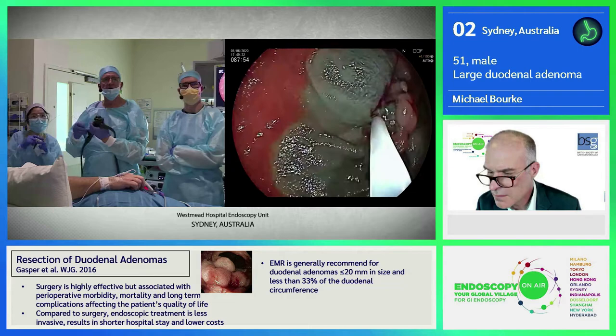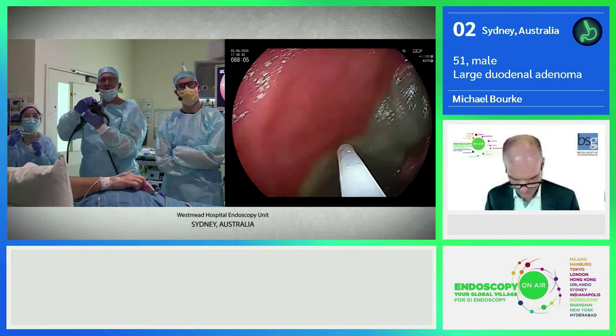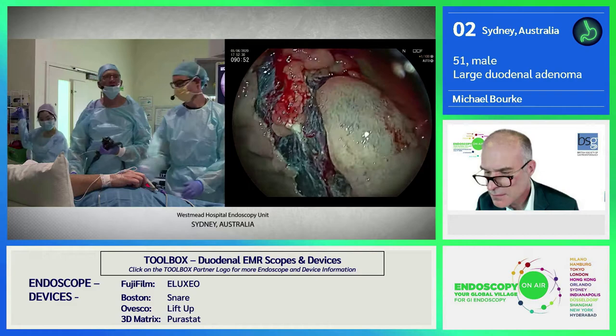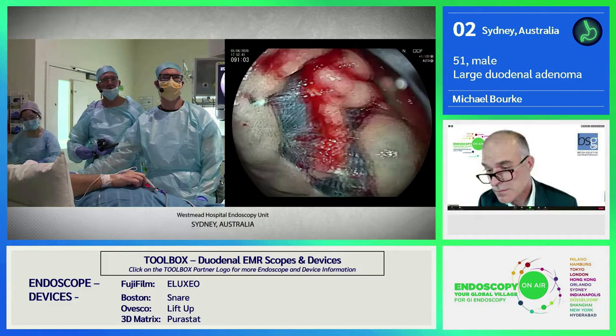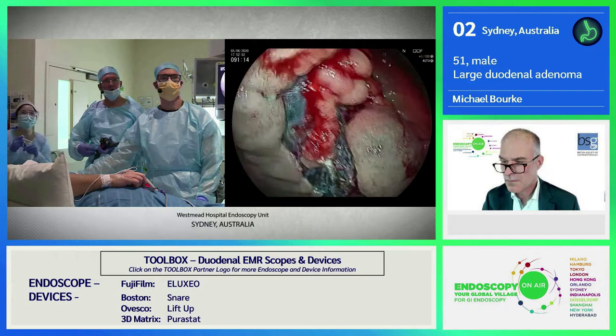And again, you see I'm working systematically from the edge of the resection defect. So I'm not just taking random pieces. I work from the edge of the defect and work my way along. So just hold the scope here. Okay, so I changed to, so whenever there's a scarred area, you have to be more conservative. So we changed to a smaller snare. We'll submit this scarred area separately for histology. And we'll flag the fact that we're worried there could be something else going on, such as submucosal invasion. I think there won't be, but it's possible. Open things.